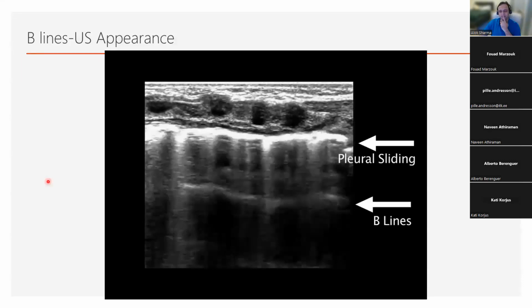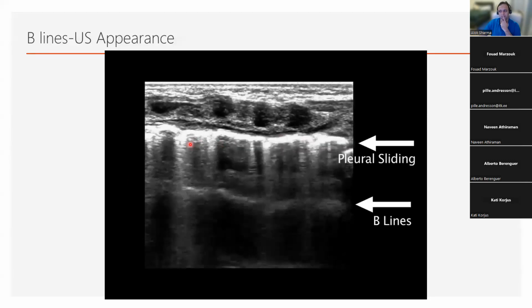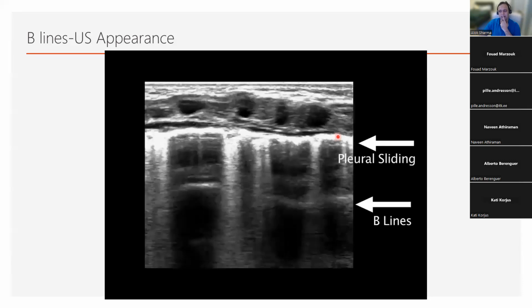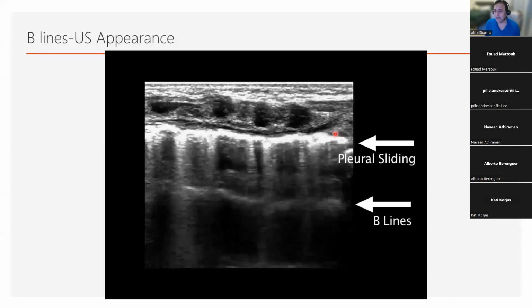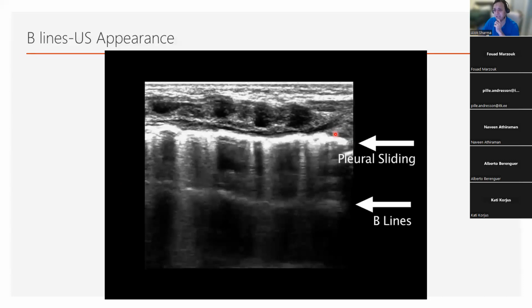I think the pleura here is thick, sliding, and there is a subpleural consolidation also. Okay. So we've got a slightly different point of view. So if I tell you that this is a term baby in air at 60 minutes with absolutely no signs of respiratory distress.